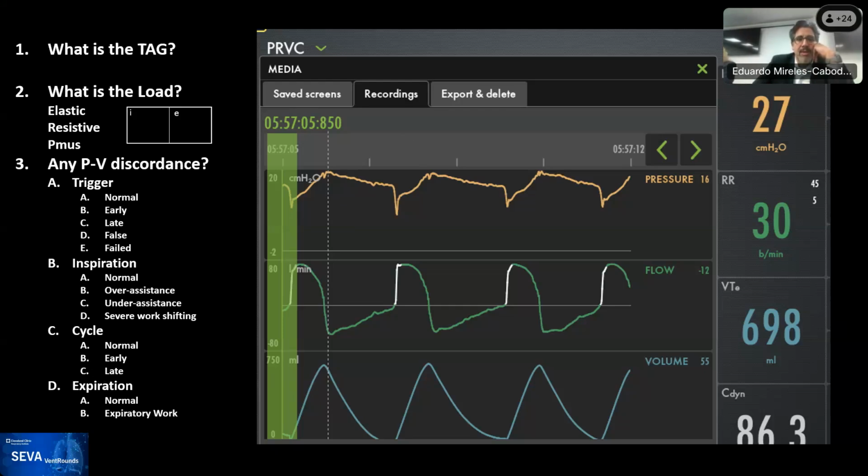All of them are the same thing. So thank you, Ariel. Volume Guarantee is a term used a lot in pediatrics. It's one of those things that is the reason why the taxonomy exists, because you cannot make one out of each one of these names. They are more confusing than anything.